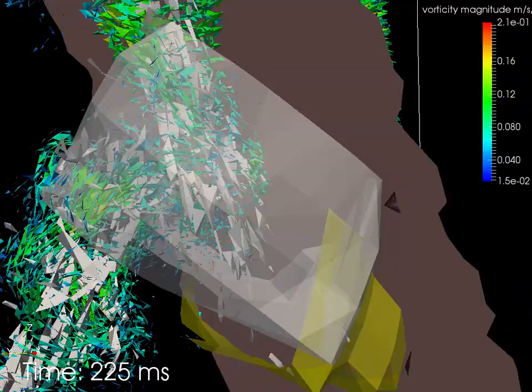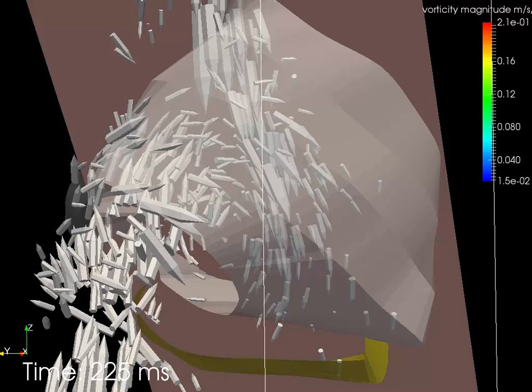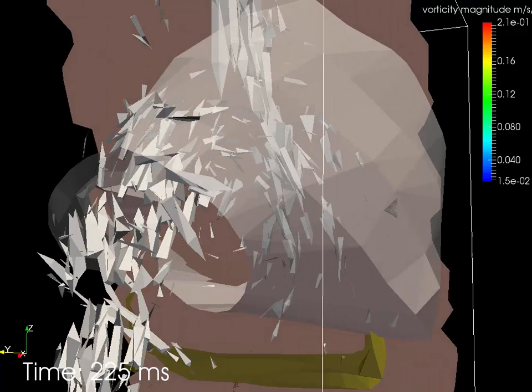There's strong vorticity generated around the IVC and from the mixing of the hepatic veins and the IVC. This flow ends up creating an overall rotation in the atrium.